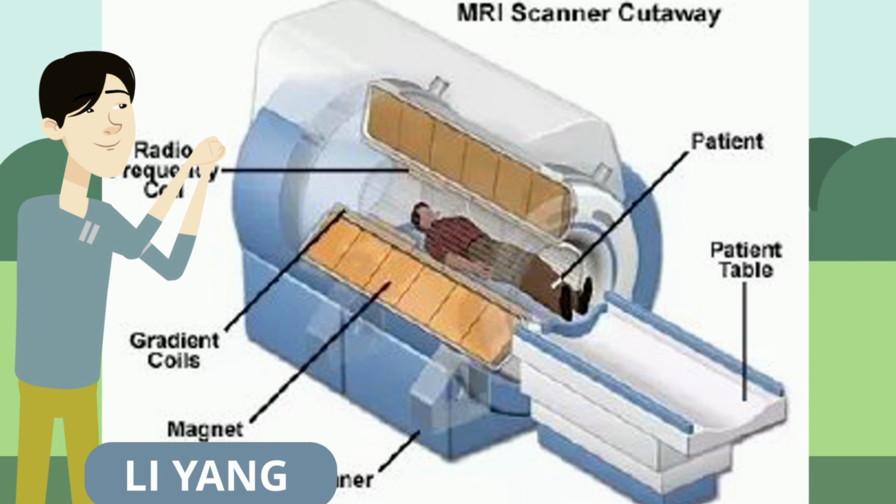In this next photo, we can see that MRI systems use a superconducting magnet, which consists of many coils or windings of wire through which a current of electricity is passed, creating a very strong magnetic field. Of course, there are other parts in this MRI machine that help make imaging possible. To maintain such a large magnetic field, it requires a huge amount of energy, which can only be accomplished by superconductivity, or by reducing the resistance in the wires to almost zero.